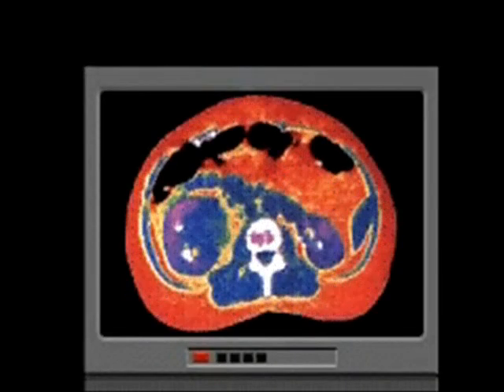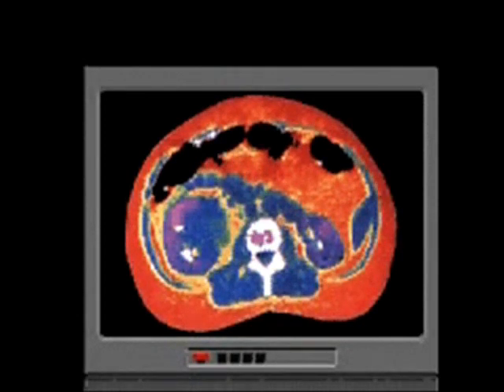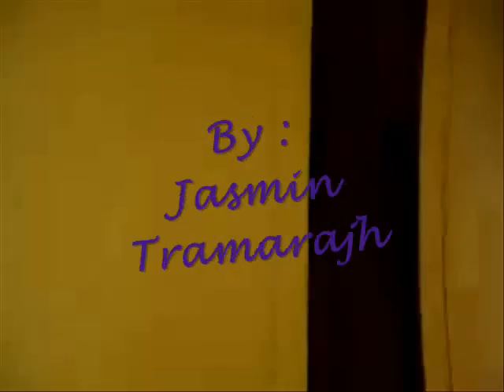A computer analyzes the information received by the X-rays and constructs an image of the slice of the body.